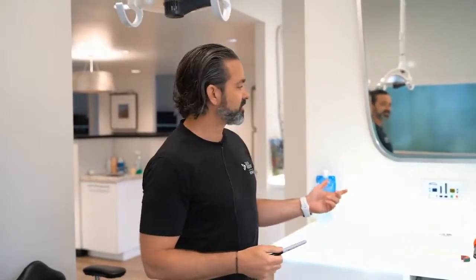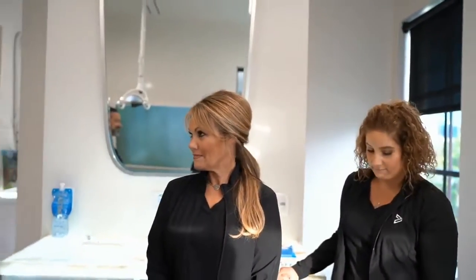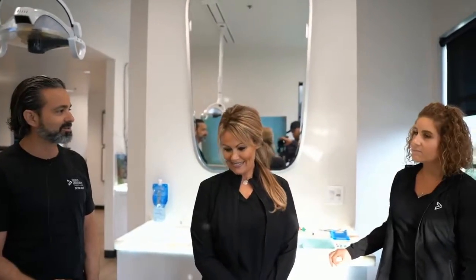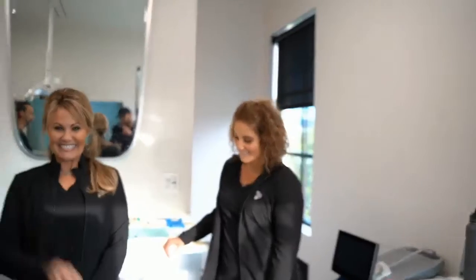So I'm going to introduce my staff. Vicki, do you want to come in here and say hello? This is going to be my assistant Vicki and Lindsay. They're going to be demonstrating positioning around this office or in the chair and how we work. So which one's going to be the mouth model? Me. Which one's going to be the assistant? All right, there you go.